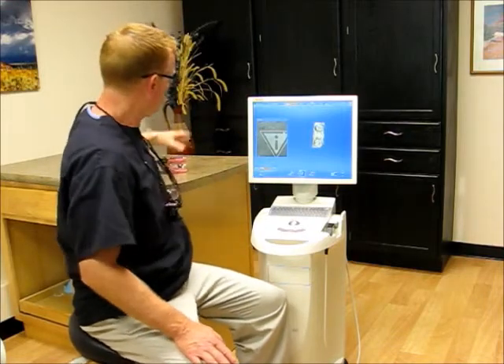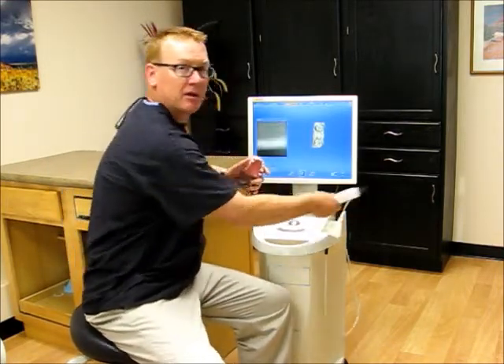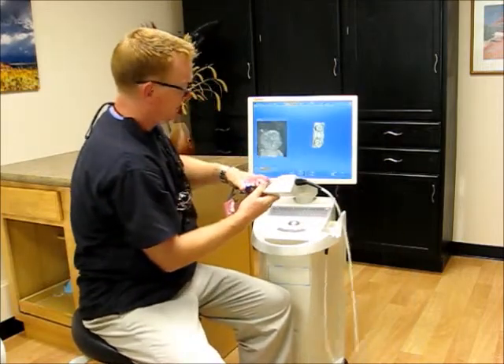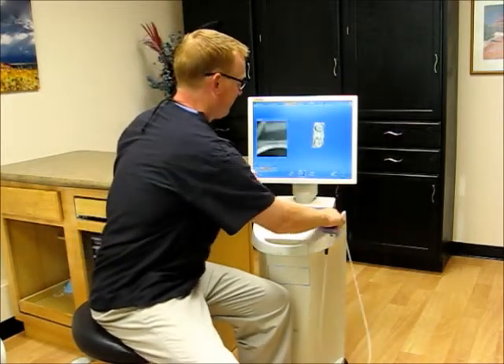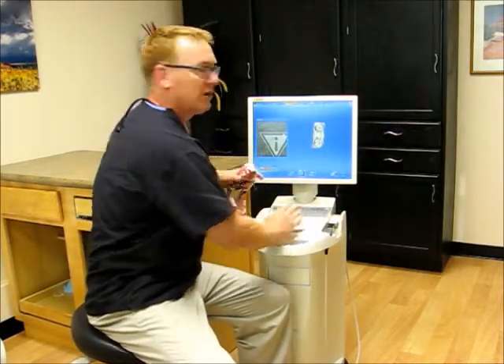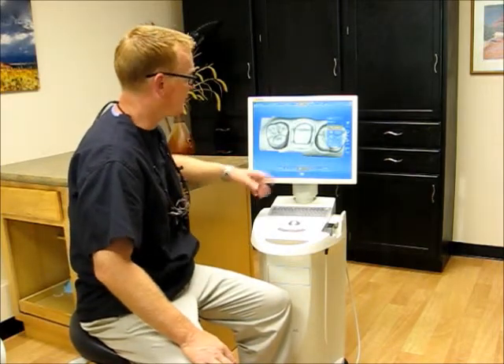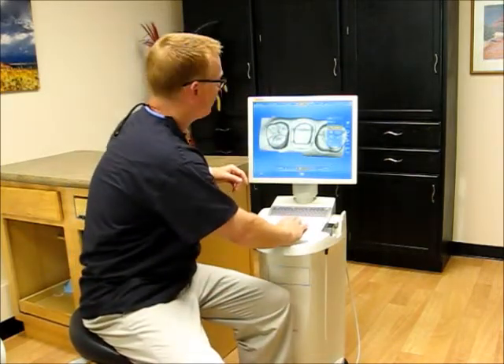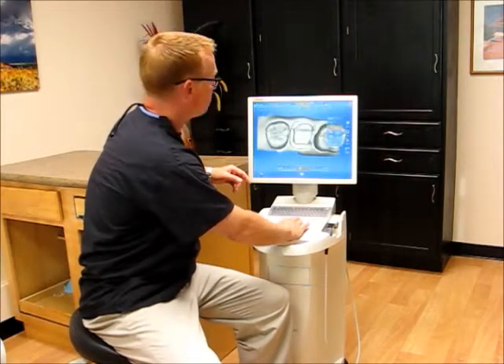Let me show you how we do it. Instead of having messy impressions, we actually use a camera which just takes pictures of your teeth. With that information, the computer actually makes a virtual model for us — absolutely clear of distortion. You can check it out. Looks great.